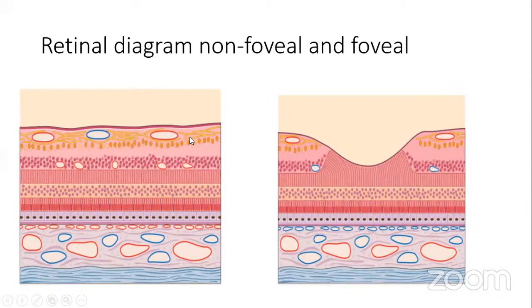So we divided the retina into two for the basis of angiography: the inner vascular layer, which is from the inner nuclear layer up, and the outer avascular layer, which is from the outer plexiform layer down. So this is where you have your big vessels in the nerve fiber layer. Those are the vessels you see on fundoscopy right away.